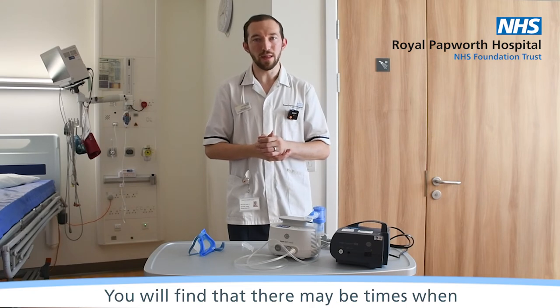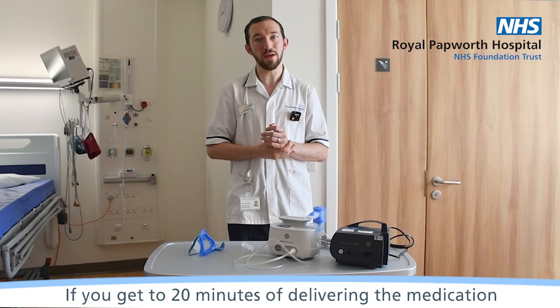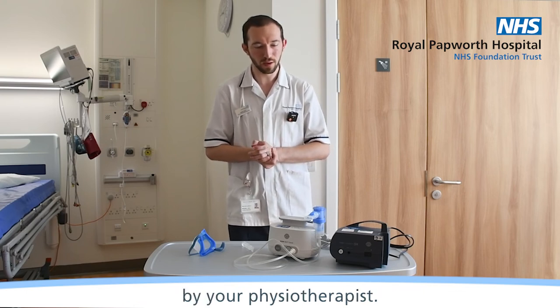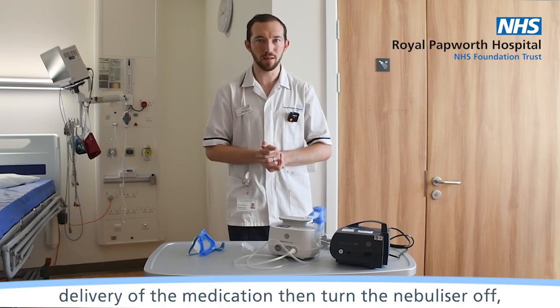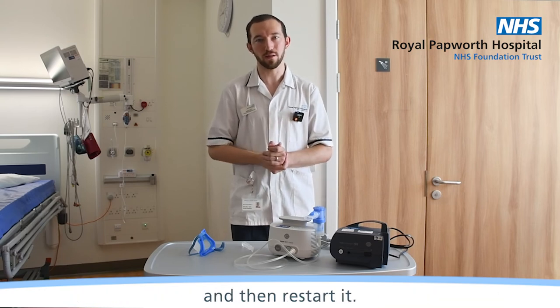You will find that there may be times when your nebuliser takes a prolonged period. If you get to 20 minutes of delivering the medication, then do stop unless otherwise advised by your physiotherapist. If you need to pause throughout the delivery of the medication, then turn the nebuliser off, do what you need to do and then restart it.